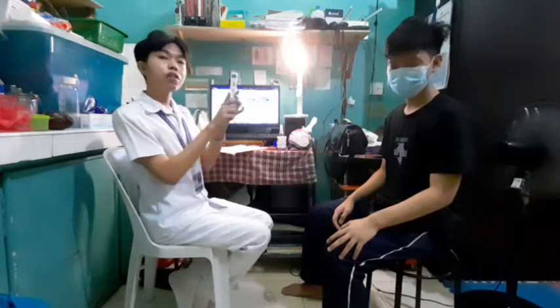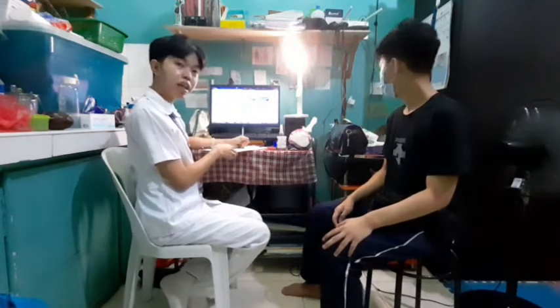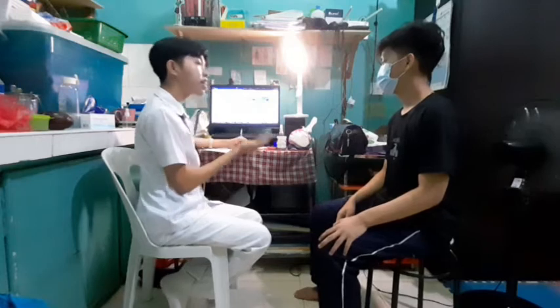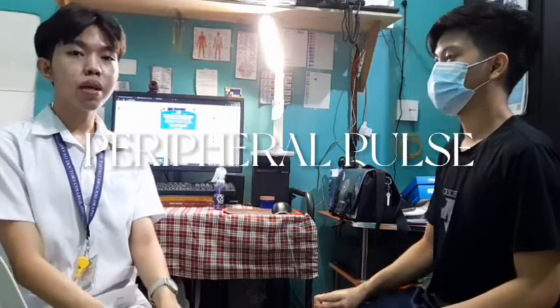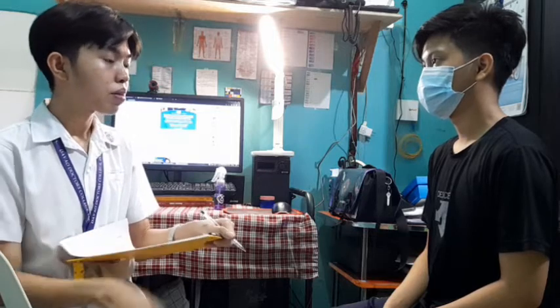I'll document the client's temperature in the client's record. Your temperature is in the normal range. Do you have any questions? Thank you. Today I will be assessing the peripheral pulse of the patient. Prior to any procedure, I must first introduce myself to the client, verify the client's identity, and inform the client about the procedures. May I know your name, please? My name is Tani Galaura and I am your student nurse for today. I will be taking your peripheral pulses. I'll just need to palpate one of your hands — is that okay?